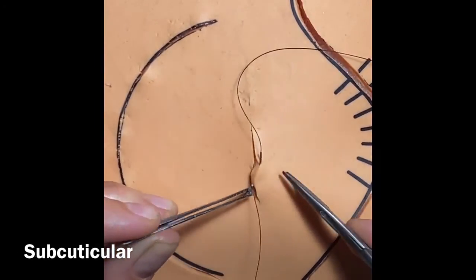You can just keep going along the same length of the wound until you get to the end. This is a stitch that you would use pretty much only in surgery or if you worked in a plastic surgery office. We don't typically do this type of stitch in the ER.